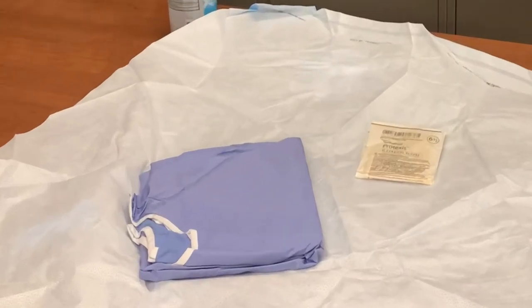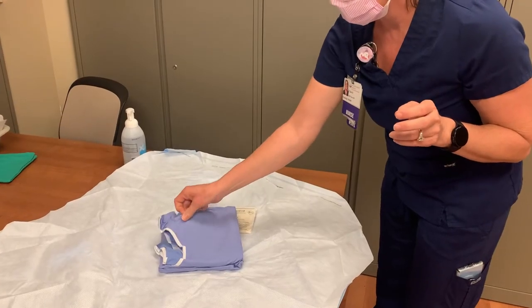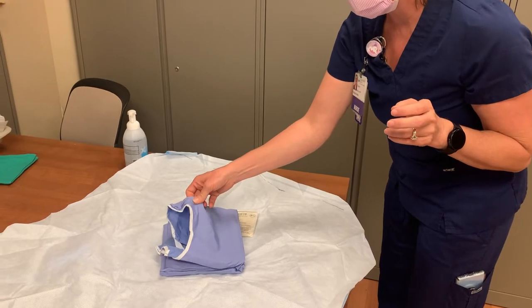The sterile gown is now revealed. It is packaged inside out. You are able to touch the inside of the gown, but be careful not to touch the outside surface, or the gown will become contaminated and you will need to start over with new supplies.